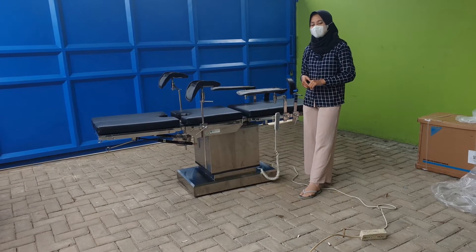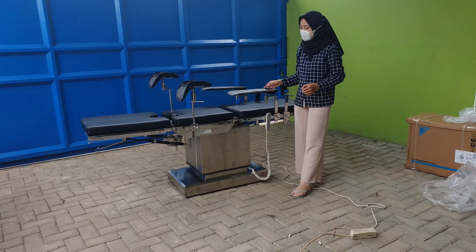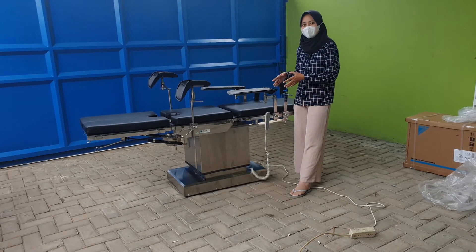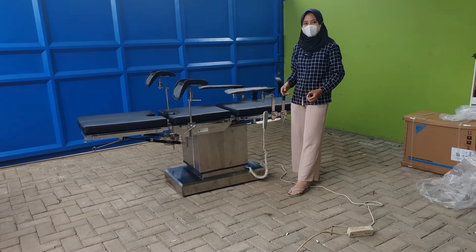Assalamualaikum warahmatullahi wabarakatuh. Kenalkan, saya Nuka Marilla. Di sini saya berkesempatan untuk mereview sekaligus uji fungsi meja operasi elektrik tiga fungsi. Seperti apa sih? Yuk kita bahas bersama-sama.